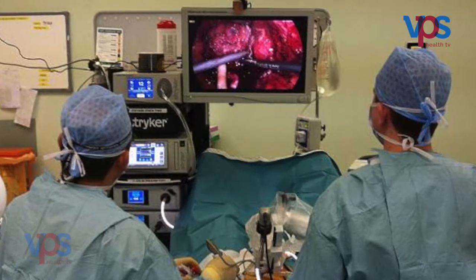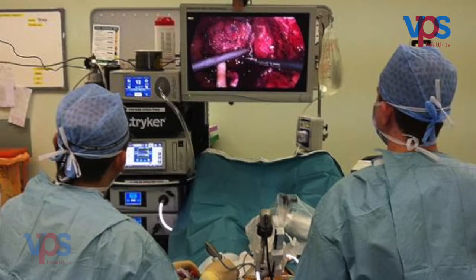The majority of laparoscopic surgeries are done using a 2D laparoscope. In 2D, we get only vertical and horizontal vision — depth perception is not available. As a result, laparoscopic surgery becomes more difficult, and many laparoscopic centers find it somewhat challenging because of this lack of depth perception.